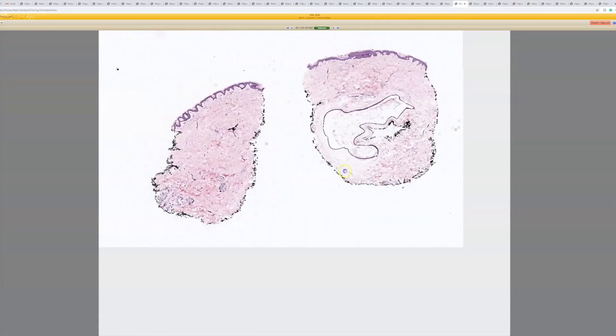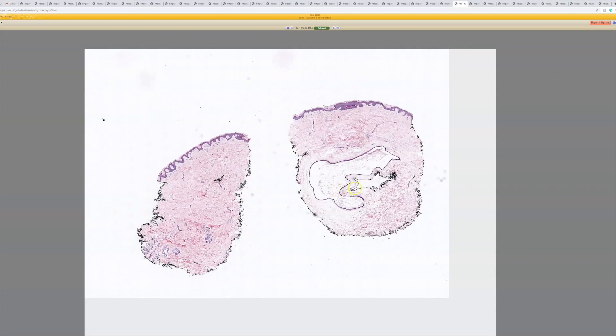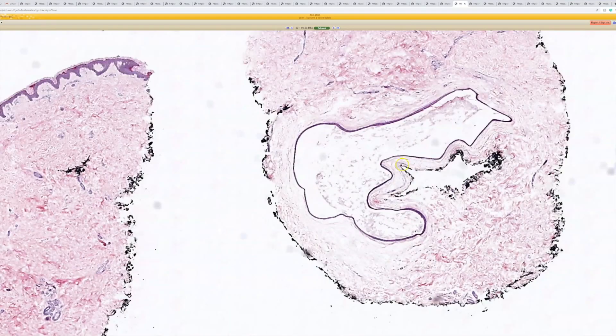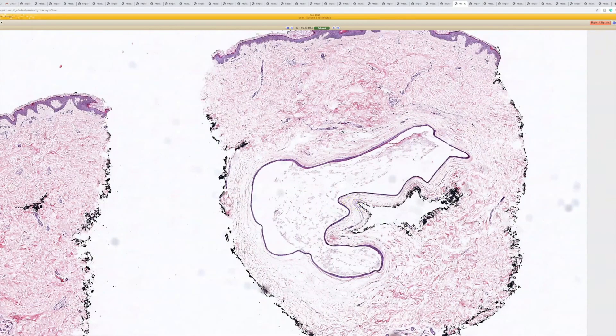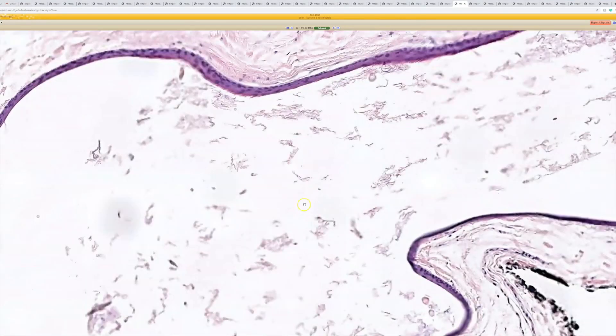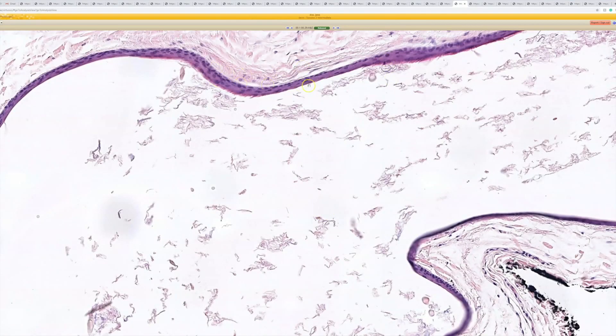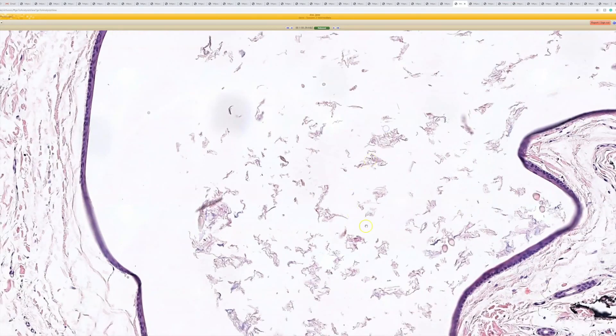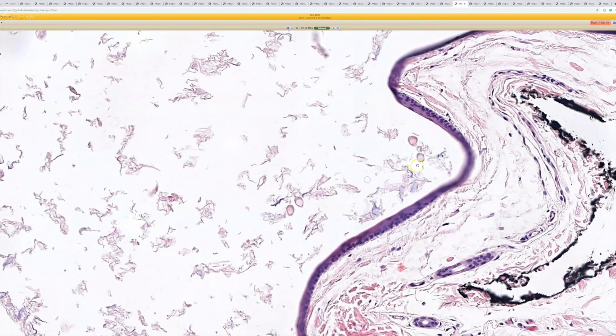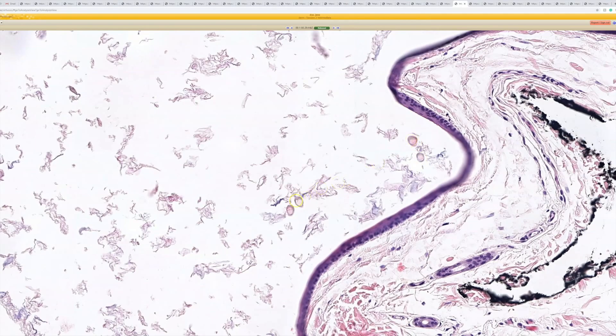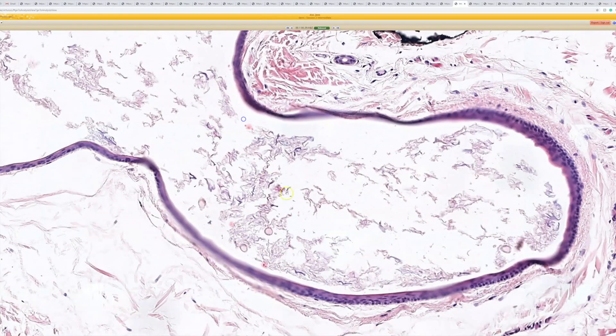Here's case 29. This one is a vellus hair cyst because there are little vellus hairs hiding in the middle. You've got a tiny cyst with stratified squamous lining, and there are lots of tiny little hair shafts and some keratin flakes and debris. So this is a vellus hair cyst.